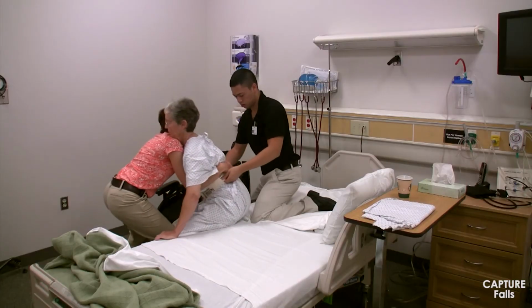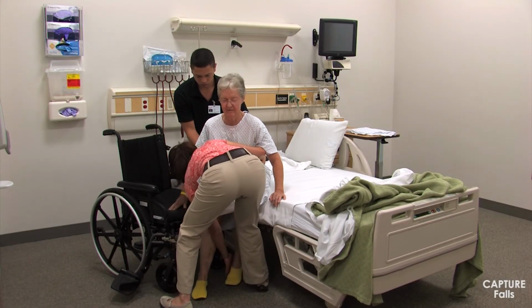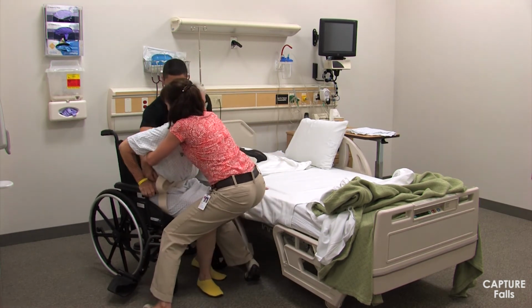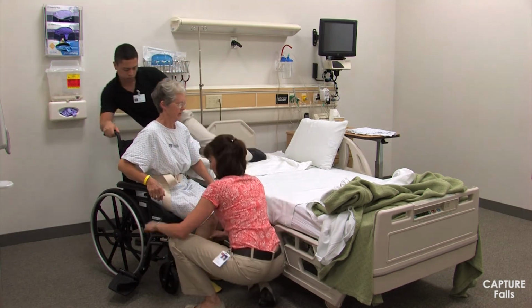You do not need to pivot all of the way into the chair at once. This video shows how you might go part of the way, reposition the patient's feet so that they don't get twisted, then complete the movement into the chair. Once the patient is in the wheelchair, make sure she is positioned comfortably and reassemble the chair.